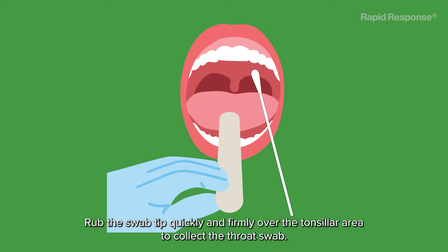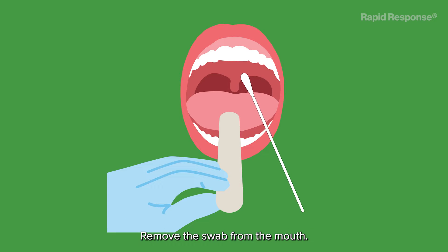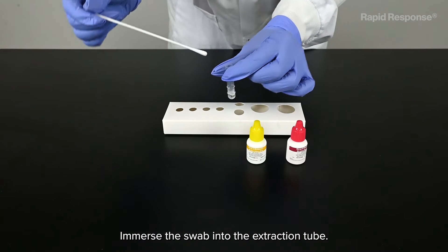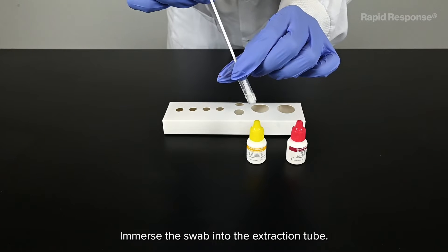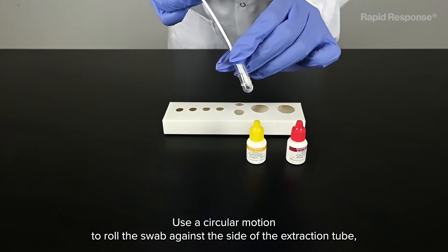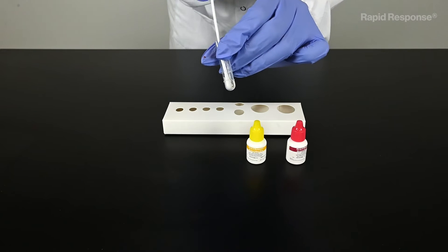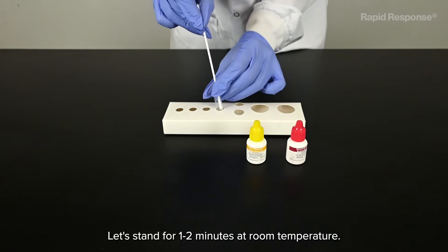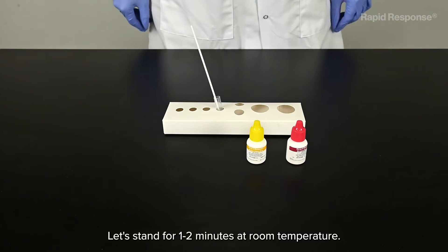Rub the swab tip quickly and firmly over the tonsillar area to collect the throat swab. Remove the swab from the mouth. Avoid touching any surface with the swab. Immerse the swab into the extraction tube. Use a circular motion to roll the swab against the side of the extraction tube.